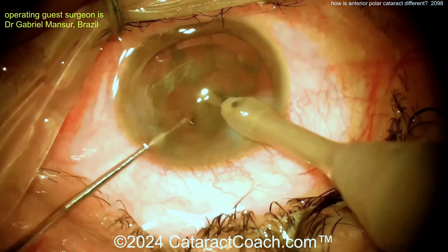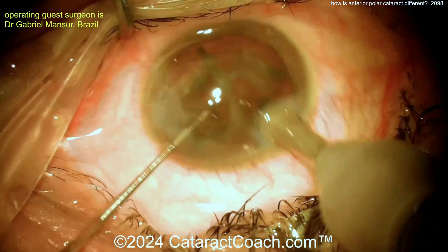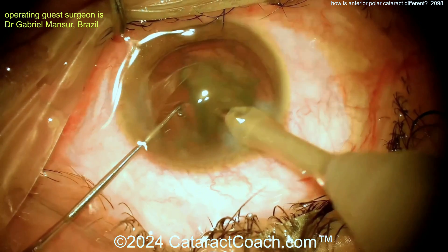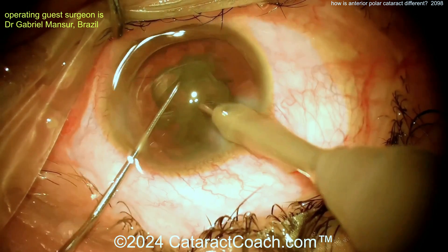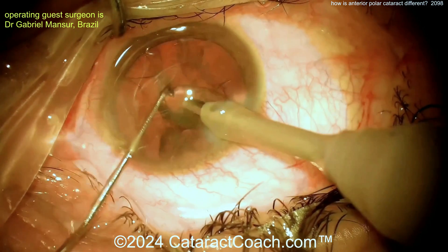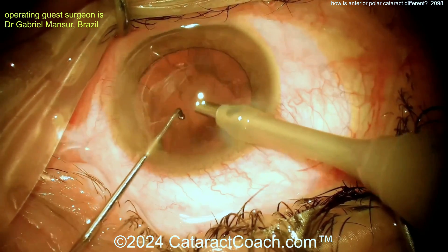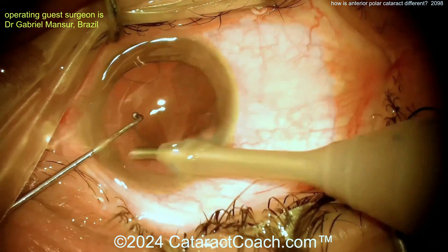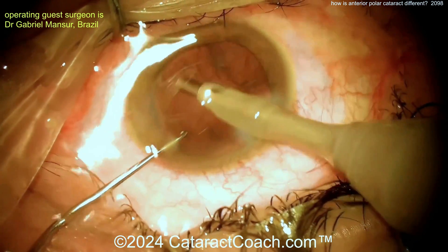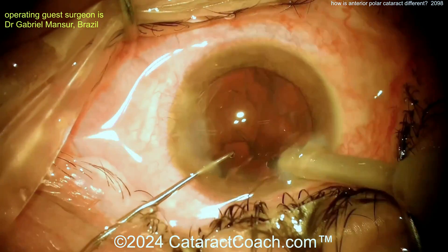Nice little rotation here as well. This patient must have a big brow because the surgeon is sitting superiorly, and you can see there's a tendency for the eye to be pushed down in infraduction — probably because of the patient's large brow. The rest of the lens comes out pretty easily; not too dense of a nucleus. Very nicely done, and the rest is going to be straightforward.